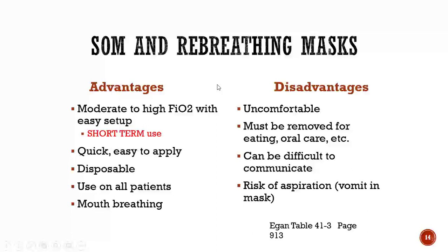So advantages of masks in general, either the simple mask or the rebreathing masks, is you can get a higher FiO2 than you can with a nasal cannula. They're quick and easy to apply. They're disposable. You can use them on all patients, and they're great for those patients that are mouth breathing. The disadvantage is patients generally find them more uncomfortable. They've got to be removed for eating or oral care. It can be difficult to communicate, although we're all getting much better with the mask communications, #COVID.